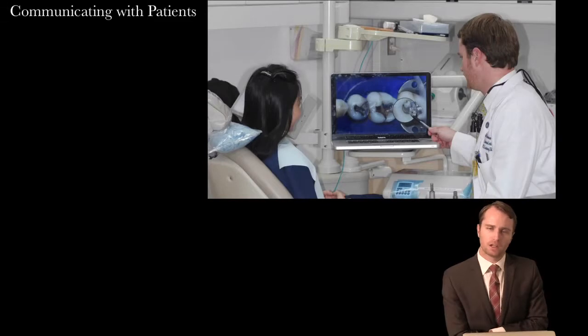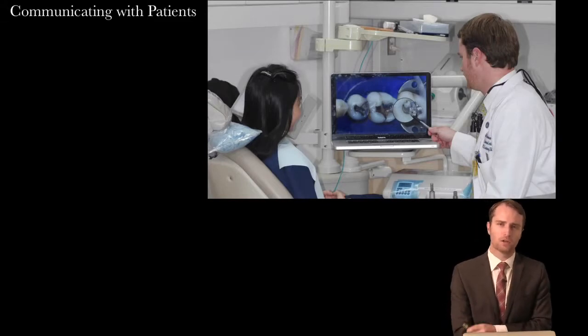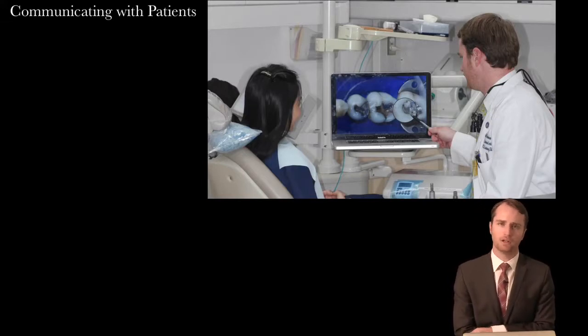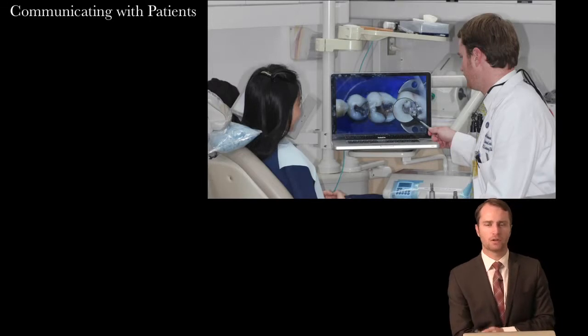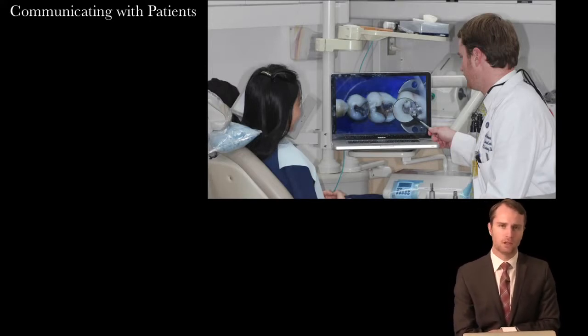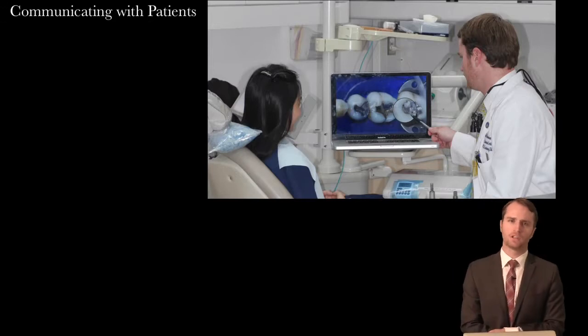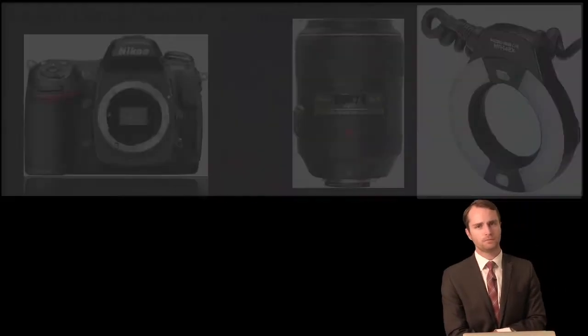So we'll spend some time talking about how to communicate with patients, how to show them clinical images of their own case, potential outcomes if it's untreated, and potential outcomes when it is treated. It's a very easy way to show them what we are capable of. Too often we talk to patients and they leave with no clear idea about where the process is going to end up. Dental photography will easily help remediate that problem.